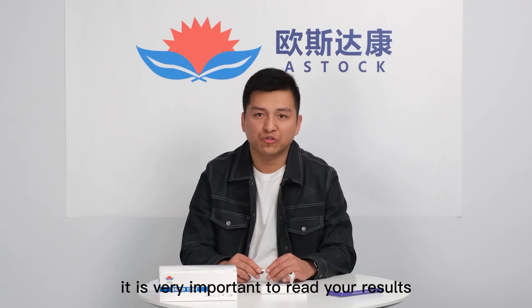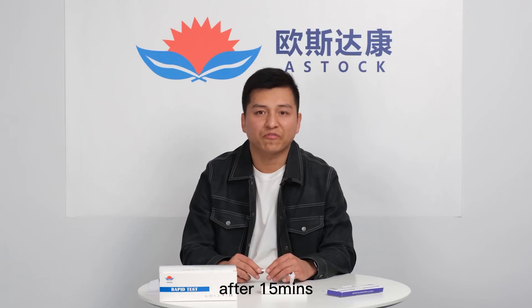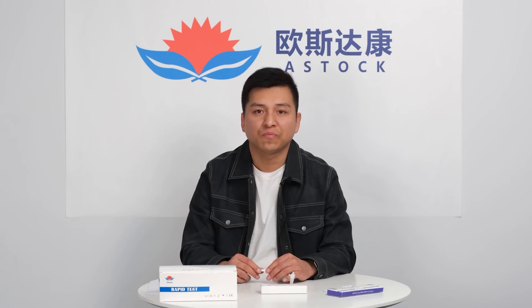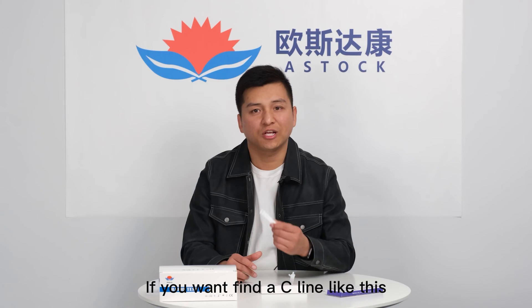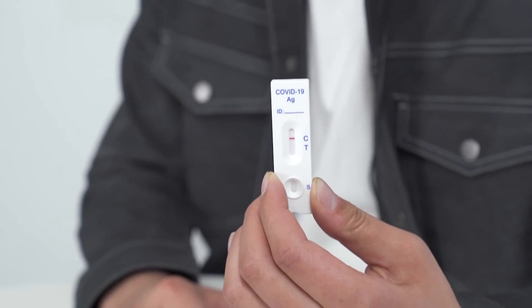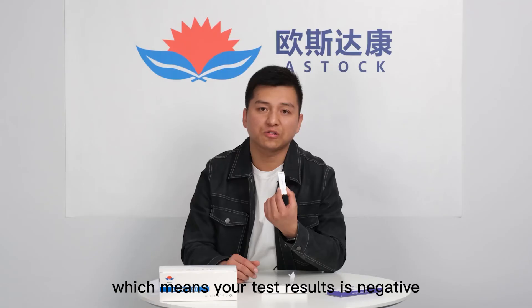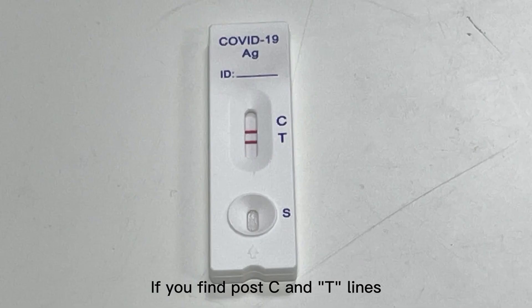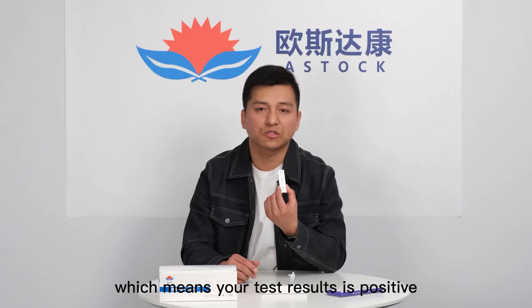It is very important to read your results after 15 minutes. You will see one line appear after a few minutes, but you must wait the full 15 minutes to know your final result. If you find only a C line, your test result is negative. If you find both C and T lines, your test result is positive.